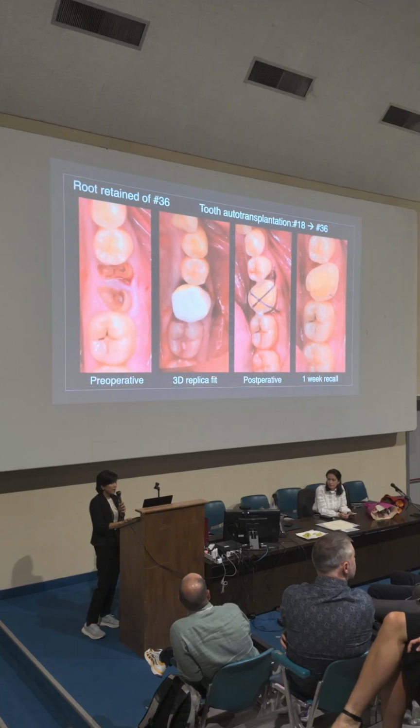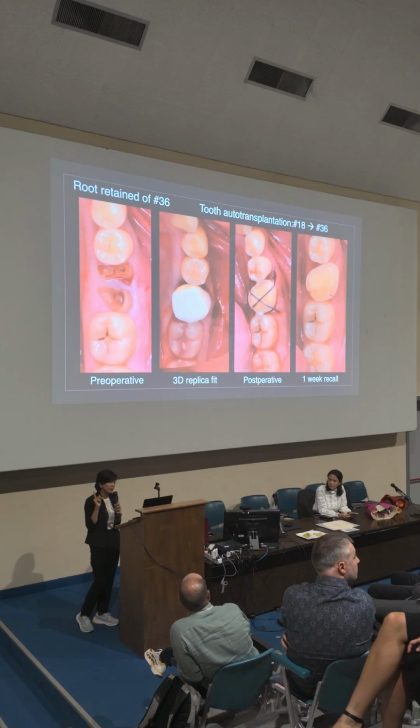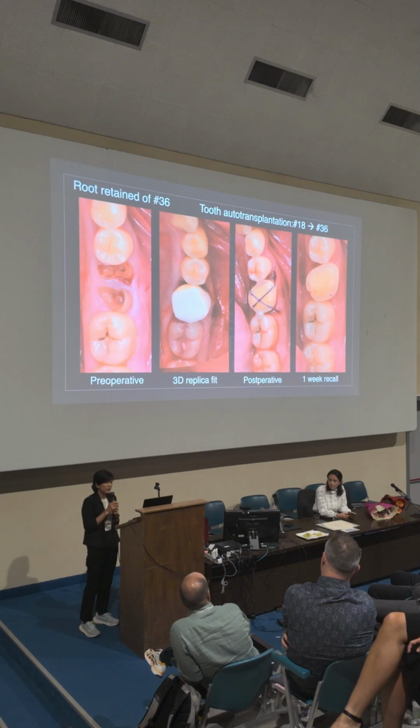And for the other side, I do the same procedure. But in this case, because the morphology of the root is quite different between an upper wisdom tooth and lower molar, I try to print the 3D replica to prepare the socket to reduce the surgical time.